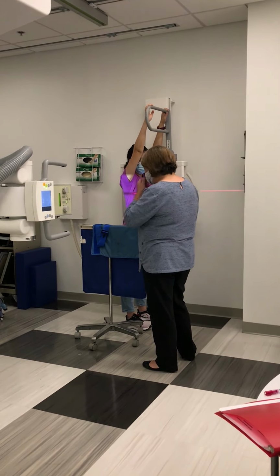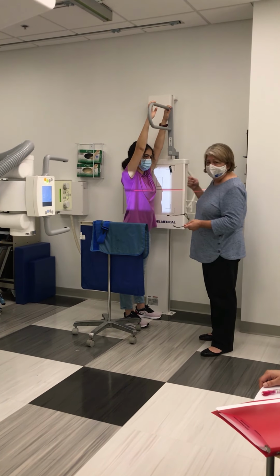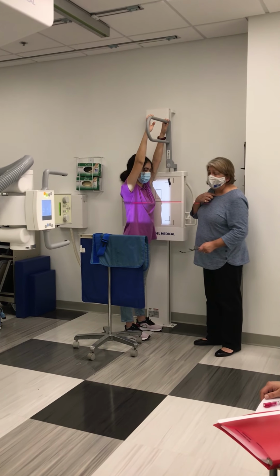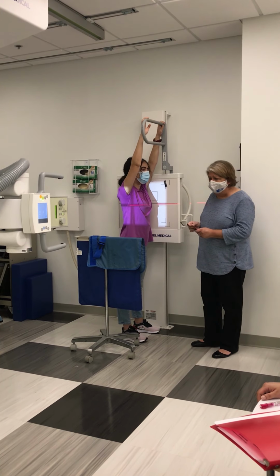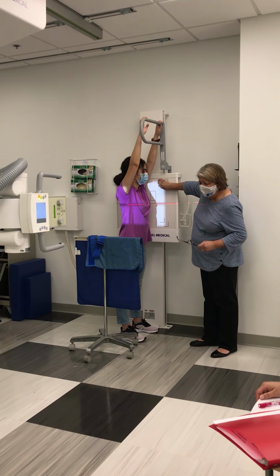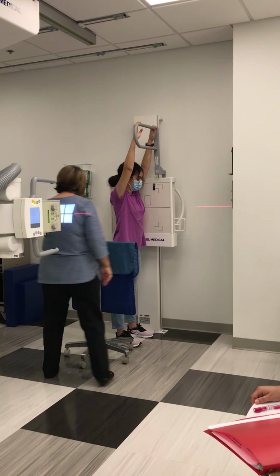Again, I'm centering at T7. Now if I'm looking anteriorly, that's about 3 to 4 inches below the jugular notch. Now I'm going to just touch lightly, just a place on your neck here, so you feel for that indentation. And you eyeball, measure down about 3 to 4 inches. And so I think I'm centered correctly at T7.